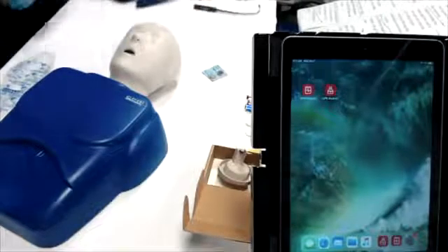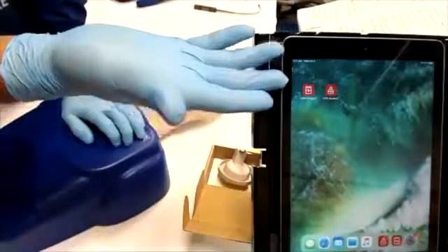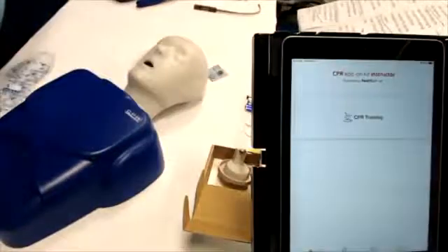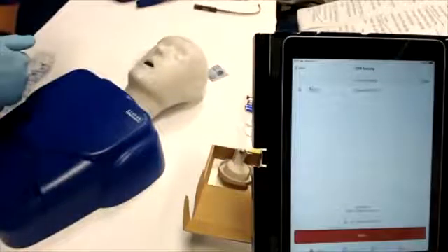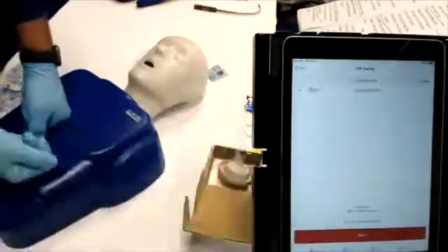Okay, there are 2 applications for CPR Plus, one for instructor and one for students. Both adult and infant CPR Plus training mannequins use the same applications. After the application is open, the instructor app will show Connect Kit. By tapping Connect Kit, the application will search for active mannequins. This app gives the instructor the capability of monitoring up to 6 mannequins and students simultaneously.